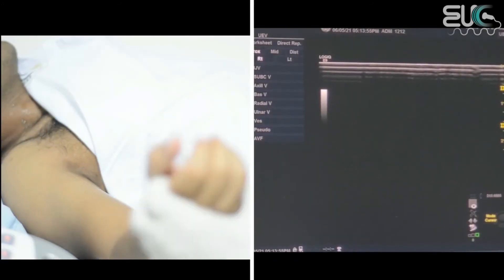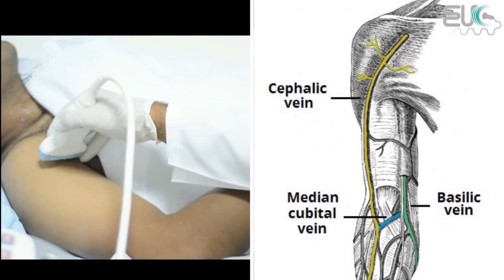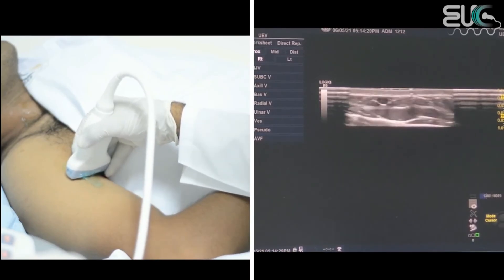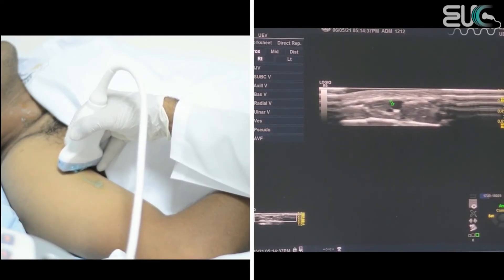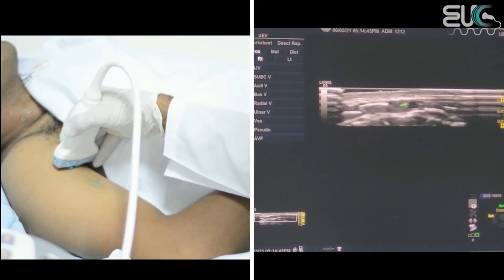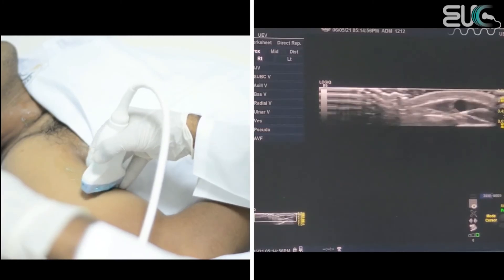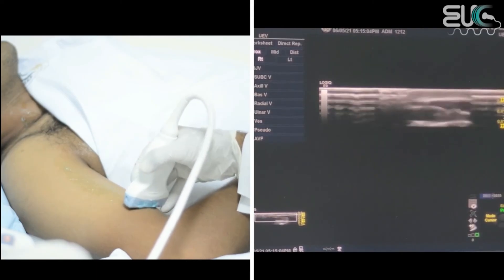The last thing to check when scanning for upper extremity DVT is the cephalic vein, which is located laterally and is a superficial vein. Sometimes this superficial vein may be too attenuated and too small to detect. I will zoom in so it is clear — here we have this superficial vessel, which is the cephalic vein. I will follow it from the upper arm to mid arm, checking compressibility throughout. It is totally compressible, which means there is no thrombus. Then I will follow it down to the lower arm.